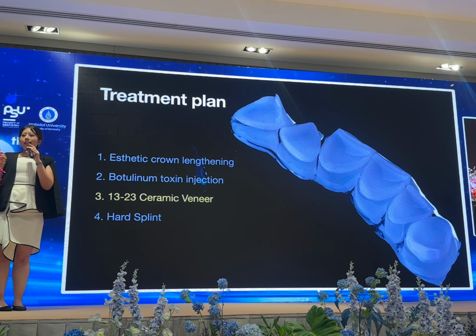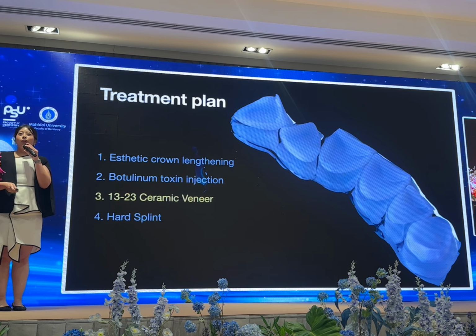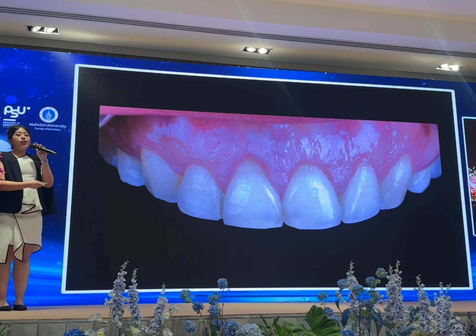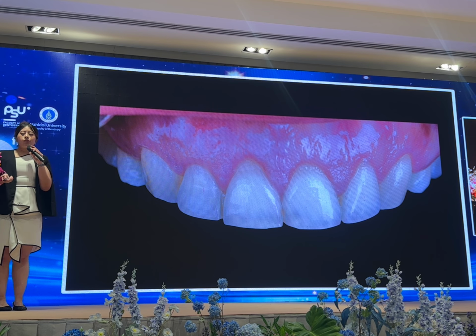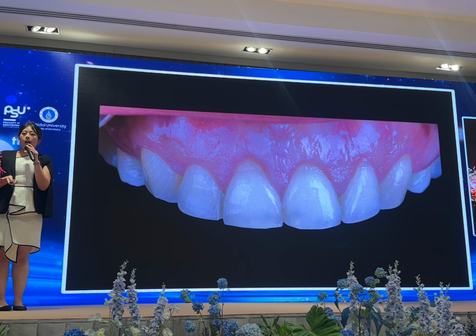Well, the next plan is our main job, the restoration. Even though the patient has undergone the crown lengthening surgery, you can see from the picture that the zenith and the gingival margin are still uneven in some parts.